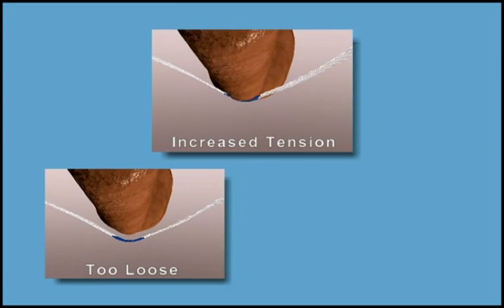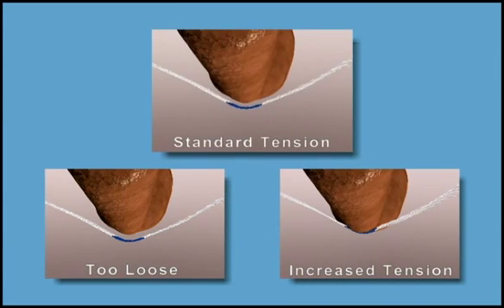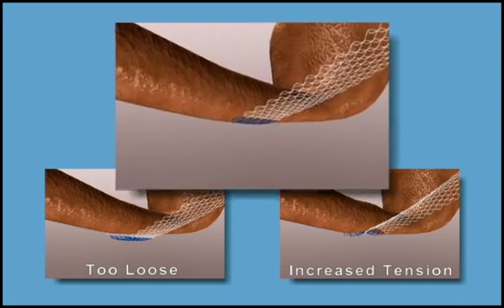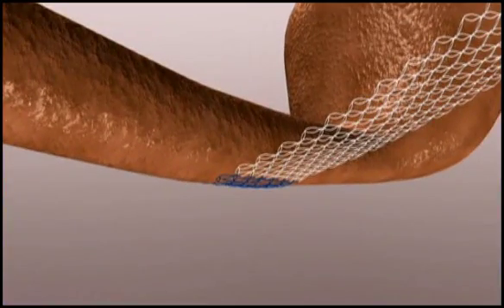The sling may have too much tension if the mesh appears to curl or roll out, or the width of the mesh narrows or may show convexity. Standard tension is achieved when the mesh lies flat against the urethra, no space between the sling and urethra remains, and the width of the mesh does not change. Note that the midline mark does not need to be centered to achieve standard tension.